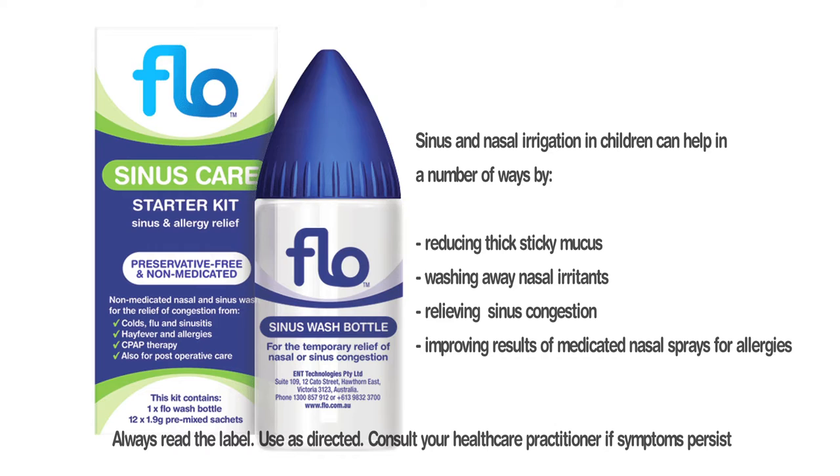Sinus irrigation or sinus washing has an important part to play in the management of children and adults who have nasal and sinus congestion. Children as young as five years of age can manage to use this form of treatment with parental assistance.